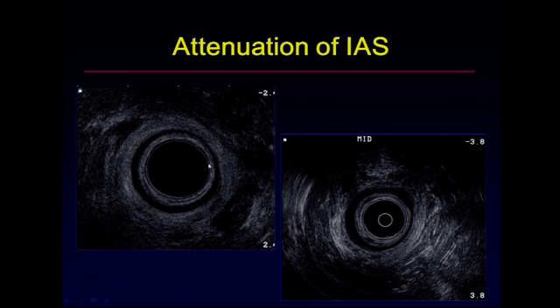Now, in this particular patient, what you can see here on the left is that both sphincters are intact, but notice that there is variability in the width of the internal sphincter, and it is quite attenuated and thinned between the 12 o'clock and the 3 o'clock position. The patient on the right has a tear in the external sphincter anteriorly, as you see here, relatively heterogeneous hypoechoic disruption of the external sphincter. The internal sphincter is intact, but notice again it is very thinned in kind of an unusual location from about the 3 o'clock to the 6 o'clock position.